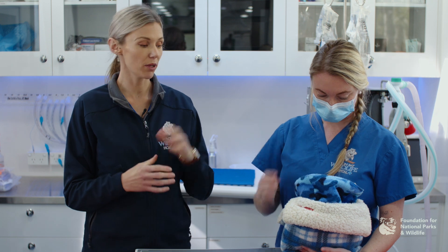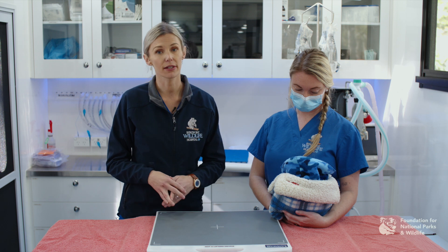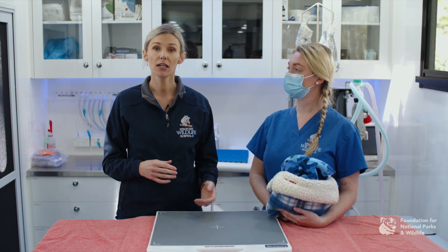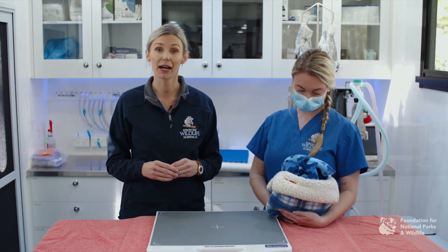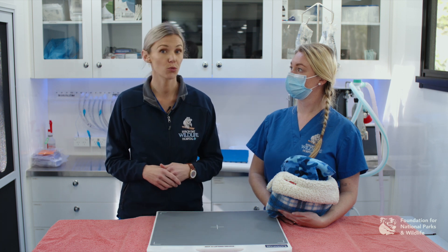Next up is taking x-rays. Taking an x-ray with a macropod or any marsupial is best done under anaesthetic. If that is not available, you can take an x-ray within the bag, but that may not be diagnostic. So if possible, please anaesthetise your animal and then set them out like you would a dog and cat — you'll do your VD and then your lateral, and any other views you deem necessary. This is especially important if you have a kangaroo that has been hit by a car, as you want to check for any calcaneal fractures, and only general anaesthesia will give you those correct positions.